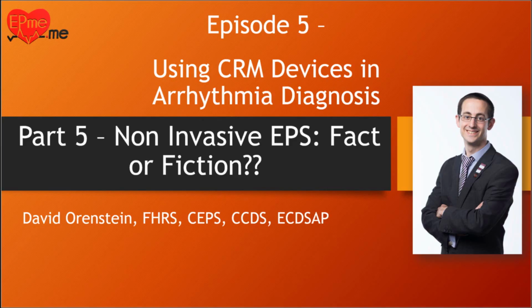One of the first things we're taught when learning to interpret EKGs is not to trust the EKG machine's report without checking it out for yourself. For example, how many times have we confused STEMI for left ventricular hypertrophy? Anyone seen that? I have.